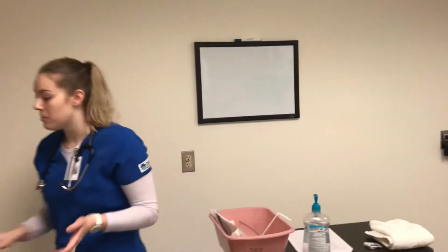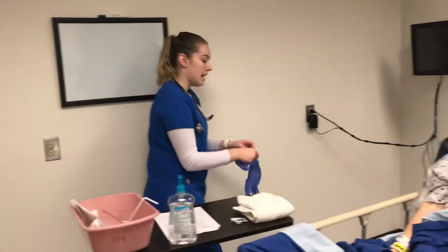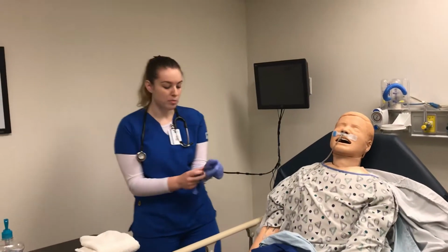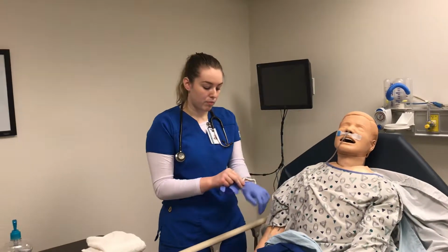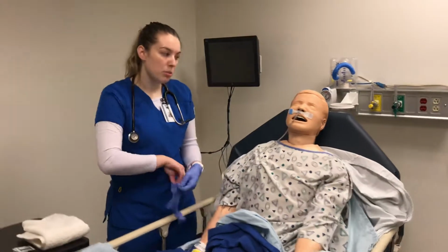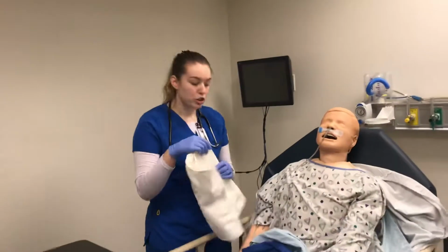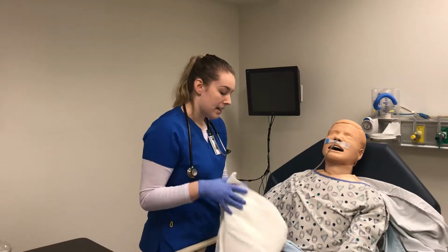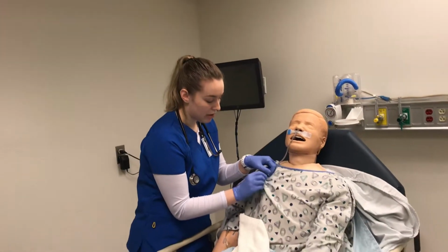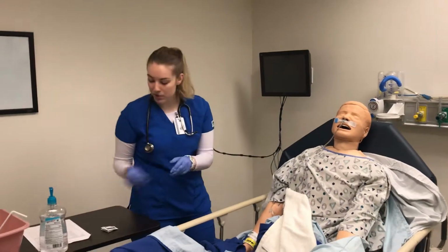So I've done my hand hygiene. I'm just going to grab some gloves. And then I can continue. So Shirley, do you have any questions for me before we remove the tube? No? Okay. So it is going to be uncomfortable again. I'm going to have you take a deep breath and then hold your breath when we're going to remove it, as it'll make it a little bit easier for you. So I'm just going to remove this from your gown, Shirley.